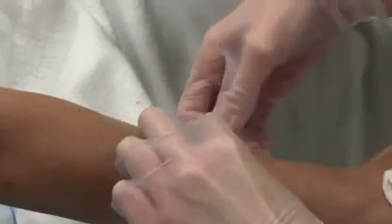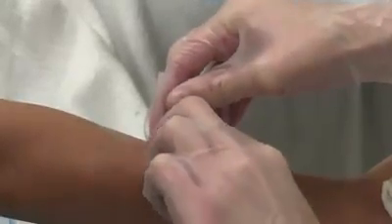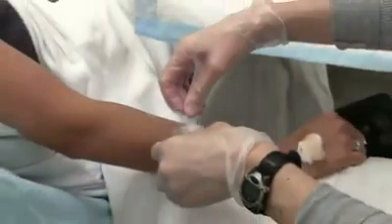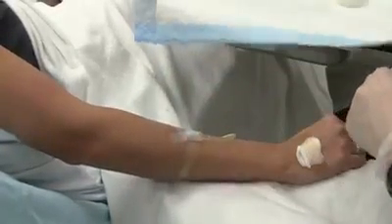You may apply a padded arm board in order to splint the joint that has the venipuncture site within it. To secure the saline lock, you may use a chevron style of taping or loop the tubing with tape.